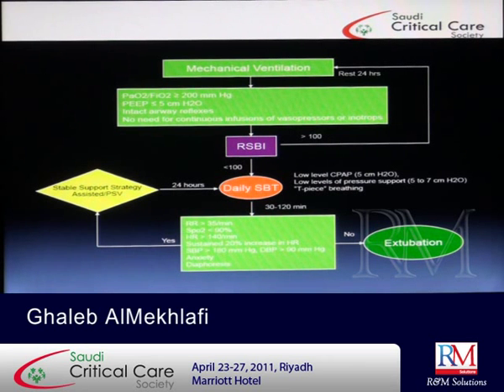If the patient did not show any failure parameter, then you will extubate. If any failing parameter is shown, then you go back for another 24 hours of mechanical ventilation and attempt the spontaneous breathing trial the next day, but not on the same day. So not more than 1 spontaneous breathing trial per day should be used.